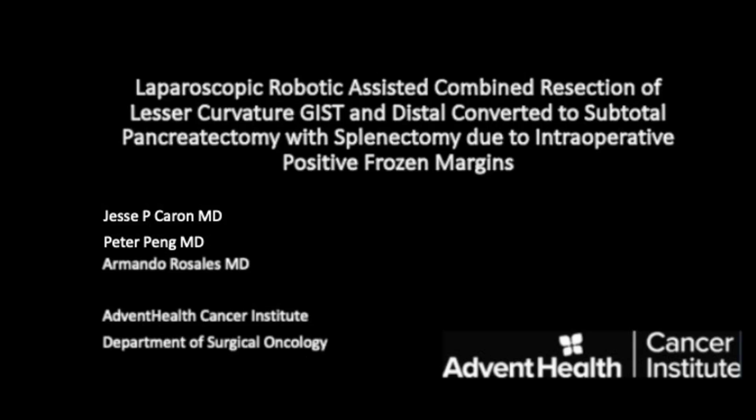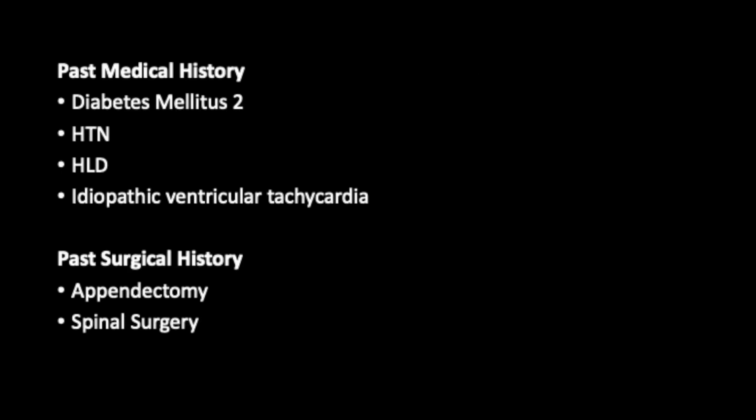Present a robotic wedge resection of a lesser curvature gastrointestinal stromal tumor and subtotal pancreatectomy for synchronous pancreatic adenocarcinoma. The patient is a 70-year-old male with a surgical history notable for remote appendectomy and recent posterior spinal surgery.